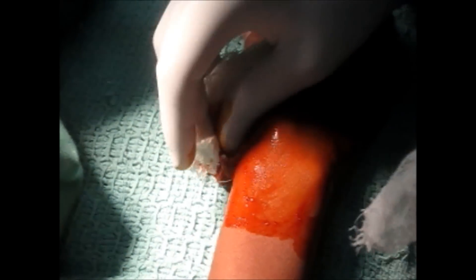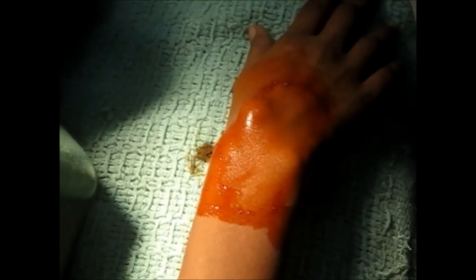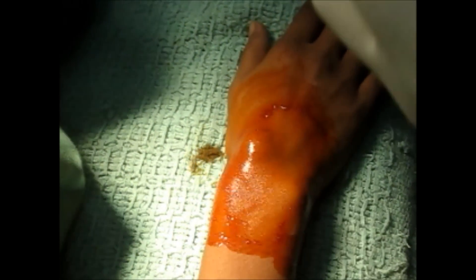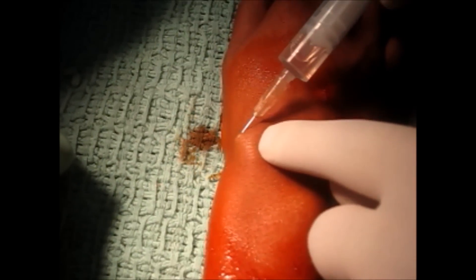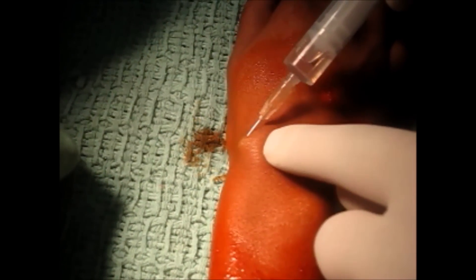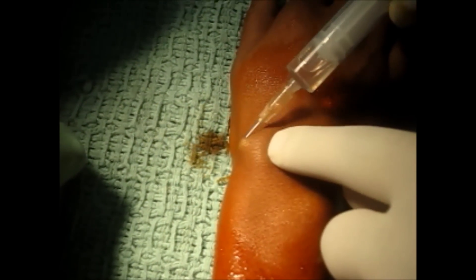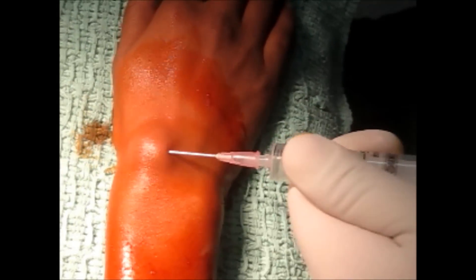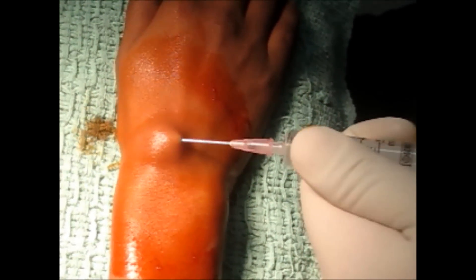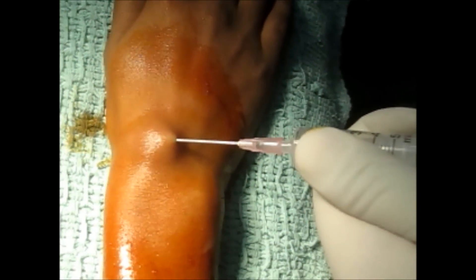Hi friends, I am going to show you how to drain a ganglion cyst. Ganglion is the most common swelling found in the body. Ganglion is also known as Bible bump or Gideon's disease.